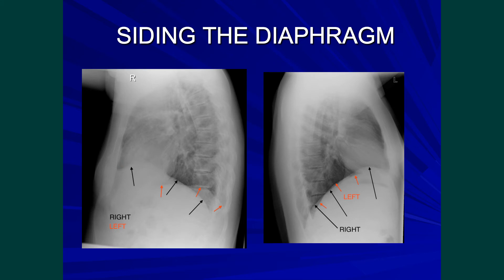This film is slightly rotated. The film on the right again demonstrates the right hemidiaphragm going from back to front without being interrupted by the cardiac silhouette. At this particular point the left hemidiaphragm becomes invisible as the cardiac silhouette sits on the diaphragm.